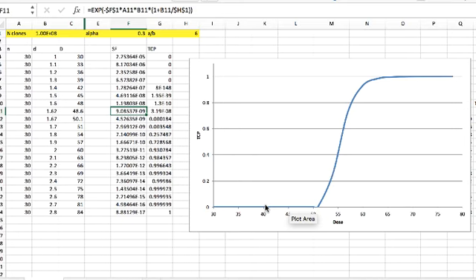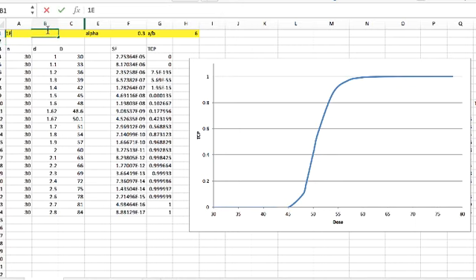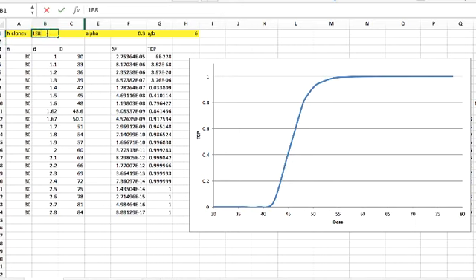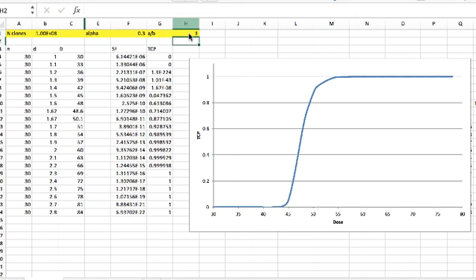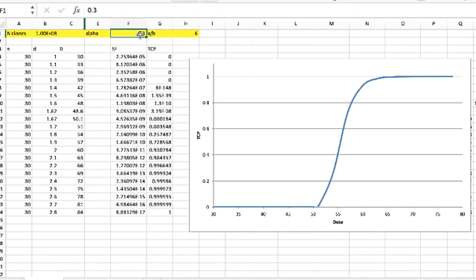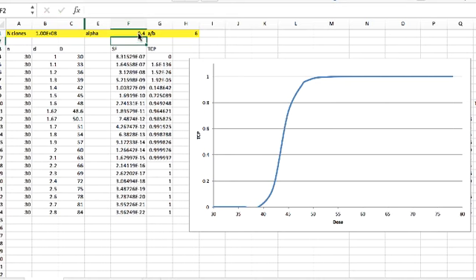You can plot this. Here I'm showing this. You see here the TCP is 0 on this graph at low dose, and then it goes up, and at high dose here you get TCP of 1, and it's a sigmoidal curve. This is for N clonogens, and the alpha over beta ratio there. So I can change these. Let me change the number of clonogens. You can just play around with this. I'm going to change it down to 1 times 10 to the 7th. You can see the curve shift. Let me do 1 times 10 to the 6th. It shifts down. Let me put it back up. You could change the alpha over beta ratio, 5, 3. Put it back up. I can change alpha, put it 0.4.